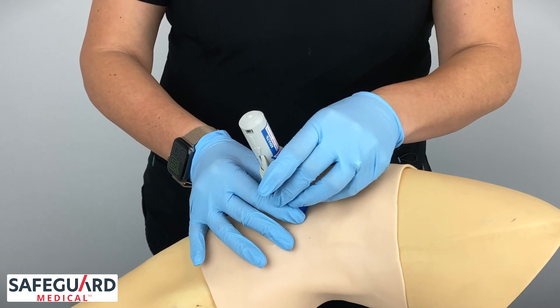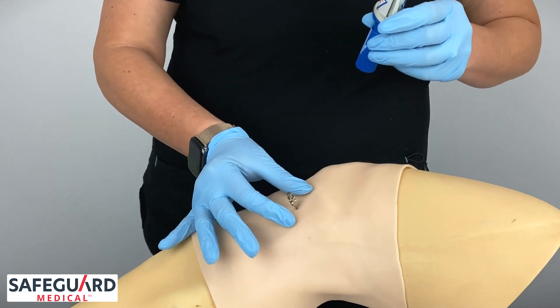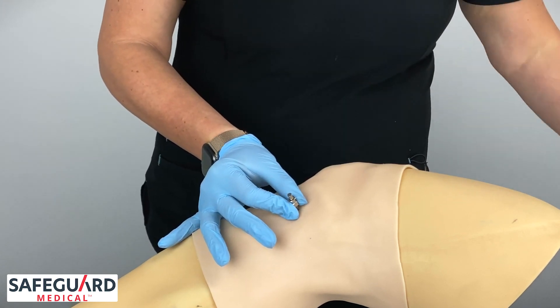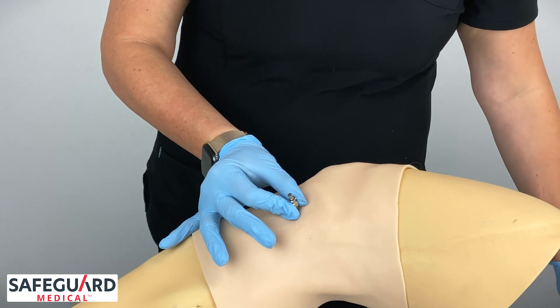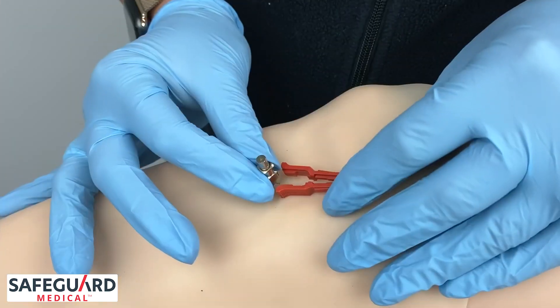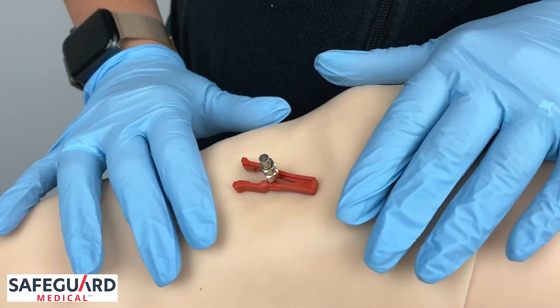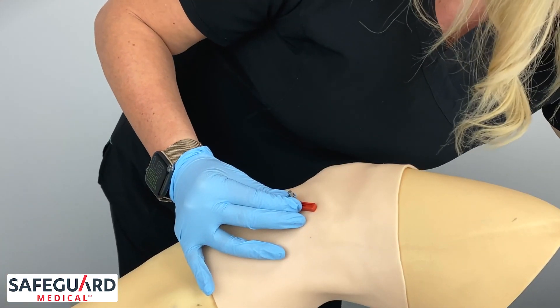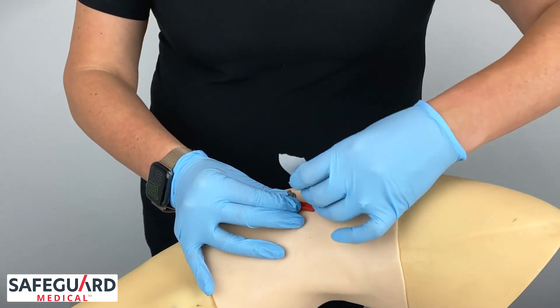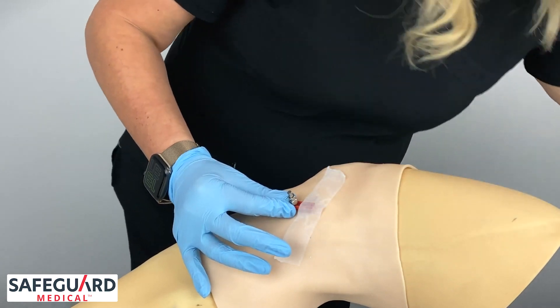Remove the BIG by pulling upward in a slight side-to-side motion. With the non-dominant hand, maintain stabilization. Use the red safety latch to clip and secure the BIG. Be sure not to move the needle when placing the safety latch. Tape the red safety latch to secure the BIG.